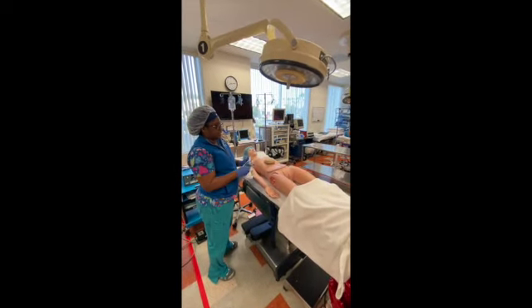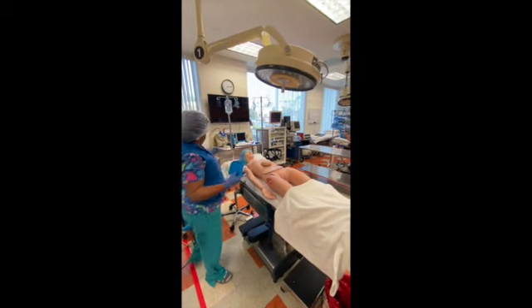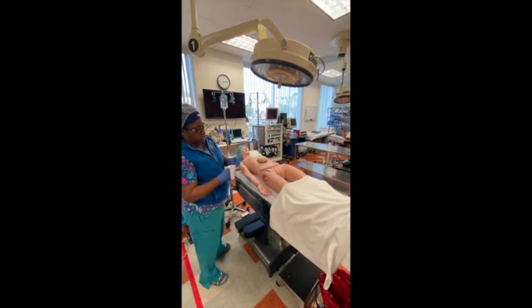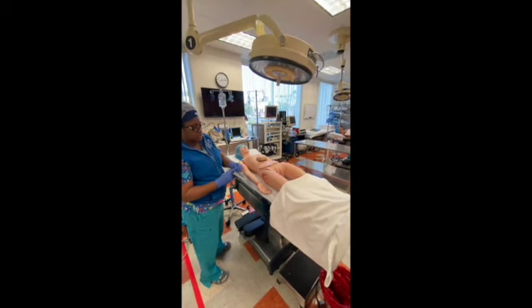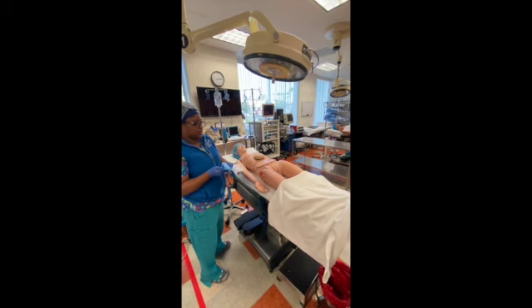A lot of nurses like to keep these packages, so we keep them and put them aside. You're going to kind of peel it like that so you can stick it back on.